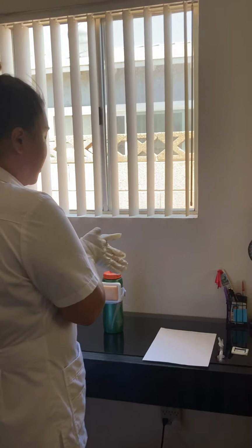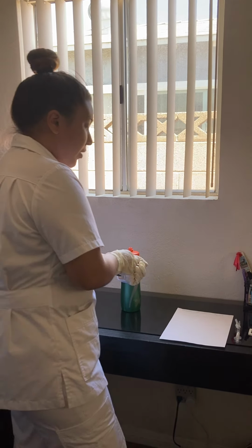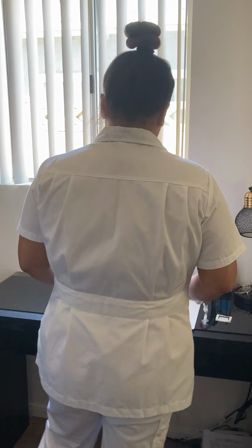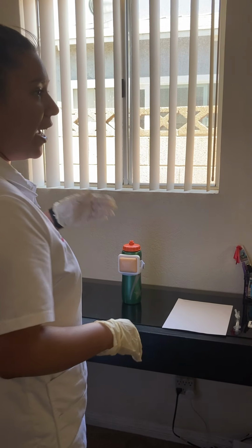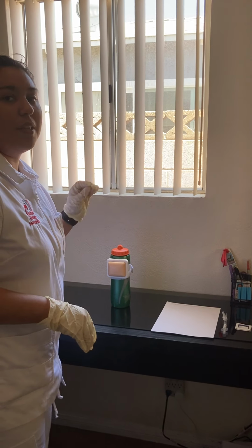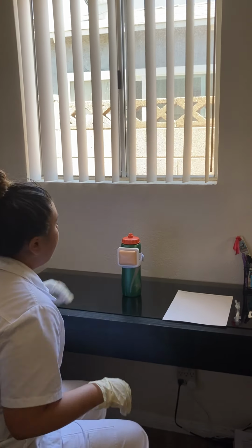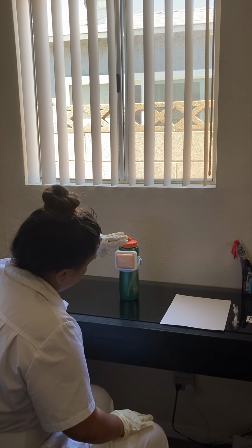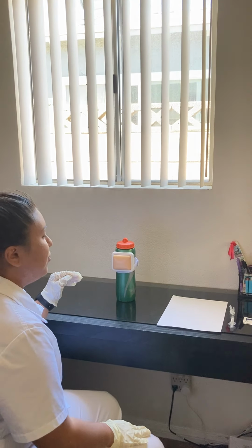And at this point, I'm going to do the third check against the MAR, and everything seems to check out. I'm going to go ahead and select the appropriate site. So for the IM injection, I'm going to use the deltoid muscle. The appropriate landmark would be the acromion process. So I would use about 3 finger width below the acromion process, and visualize an inverted triangle. At the center is where I want to give the injection.